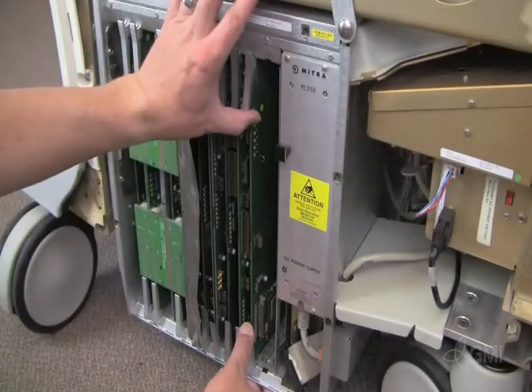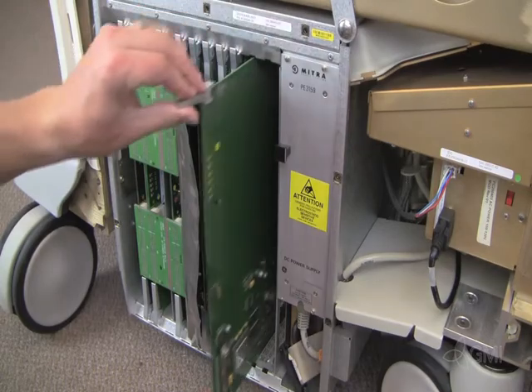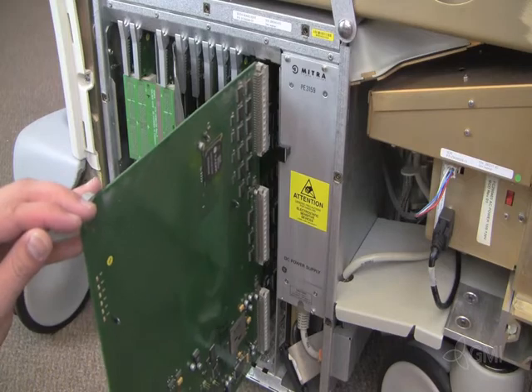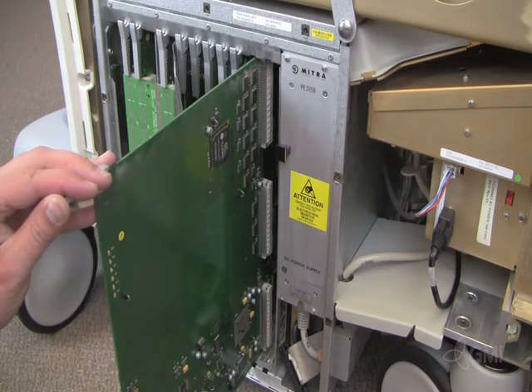Select the board for replacement. Use the board ejector tabs to unseat the board and slide out. Reinstall the board using the guide rails, then use the ejector tabs to lock the board in place.